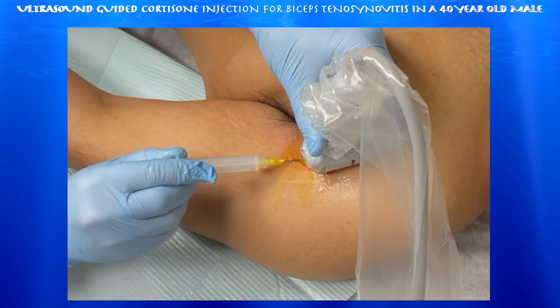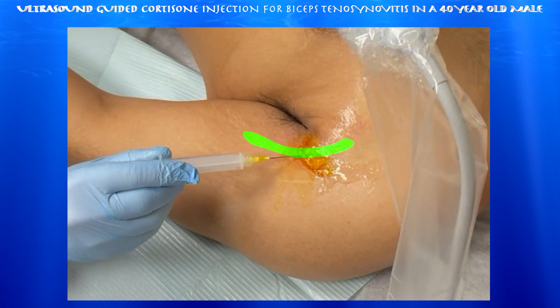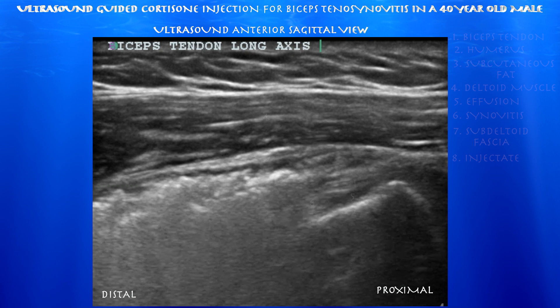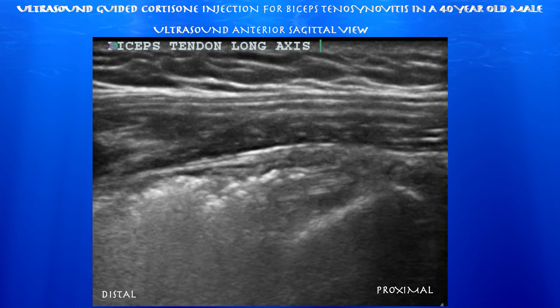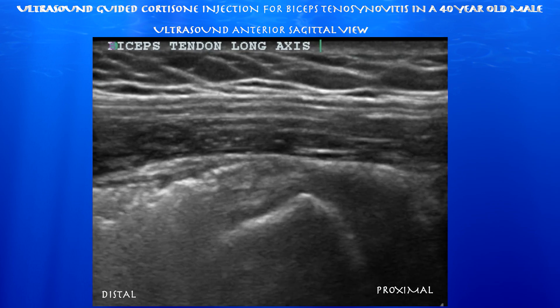Now we're pulling out. You can appreciate how the needle is following the course of the biceps tendon as it curves around towards the glenoid. This is after the procedure — just scrolling over the region of the injection, you can appreciate how the injectate essentially circumferentially contours around the biceps tendon, confirming that we were in the bicipital sheath.